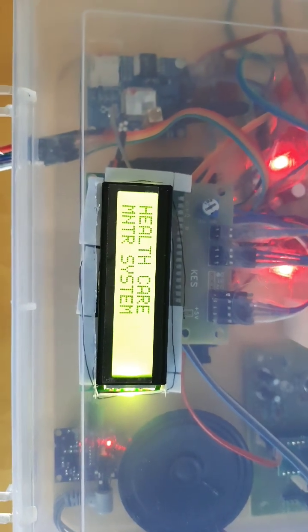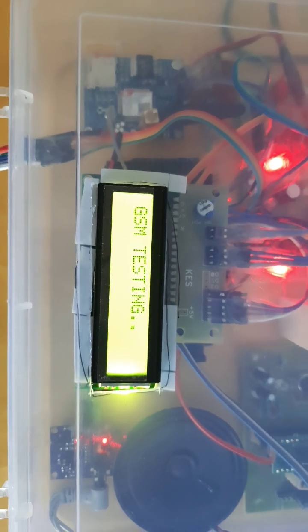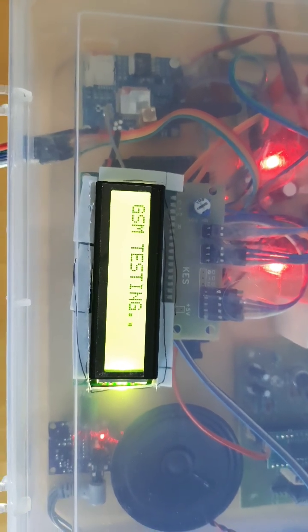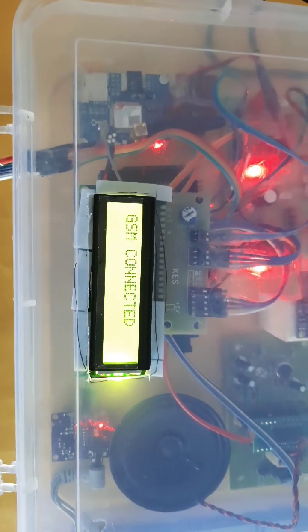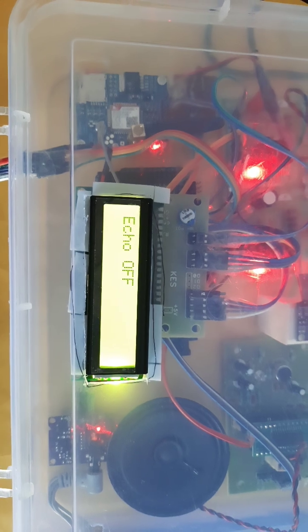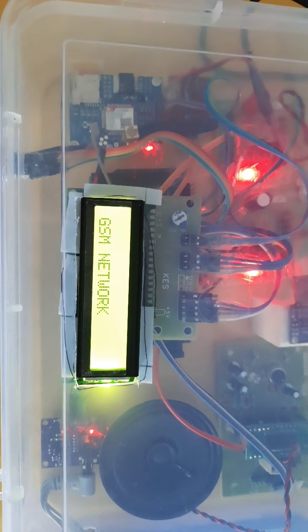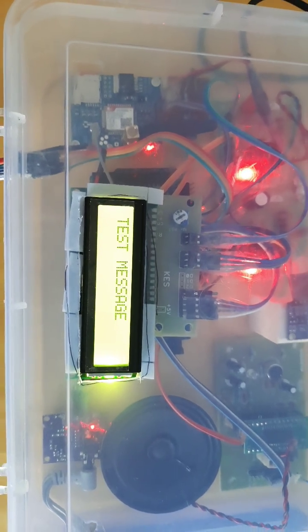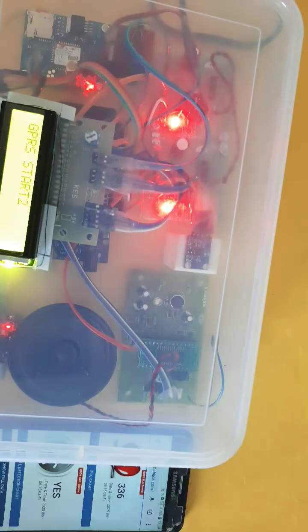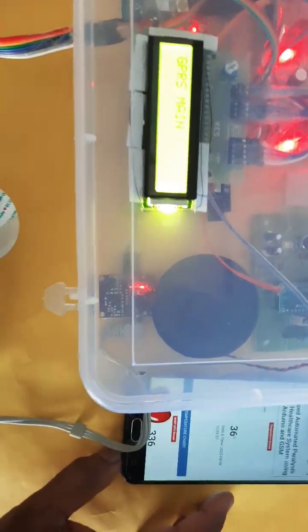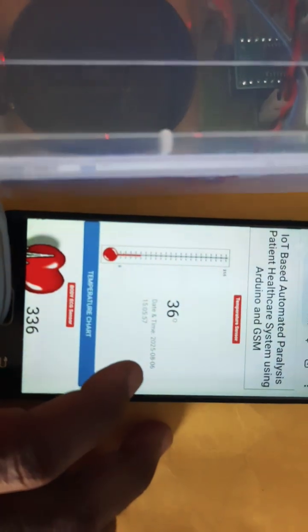The power supply is on. The monitoring system shows GSM initializing, GSM testing, connected, digital echo, finding network, test messages. This is our IoT webpage.